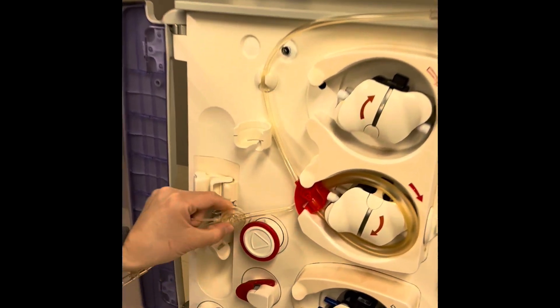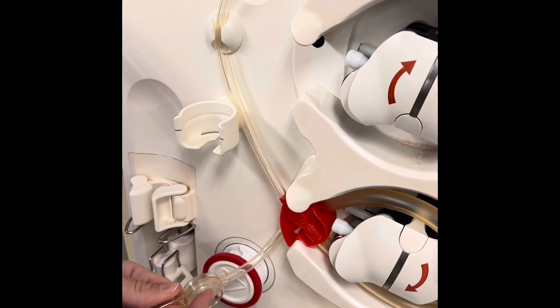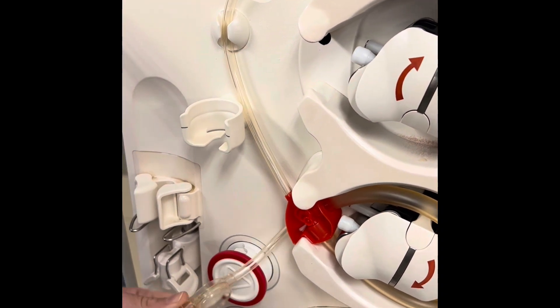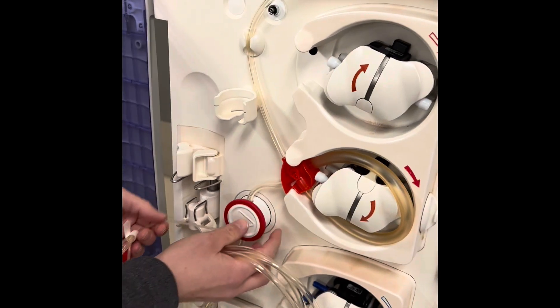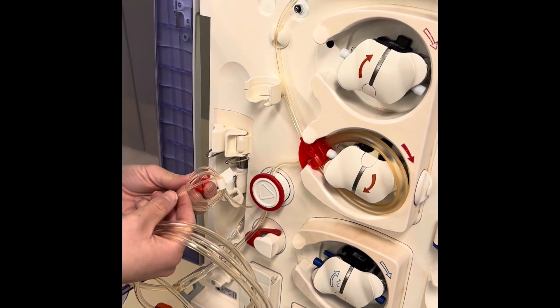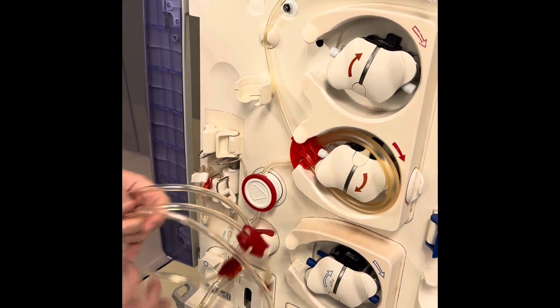Now I'm going to put my arterial dome in. This has a soft aspect and a rigid aspect — the soft aspect should be towards the machine. Please be gentle; it's very easy to break the arterial dome. This port here is for the heparin pump — we're not going to be using that, so I'm just going to clamp it and put it to the side.